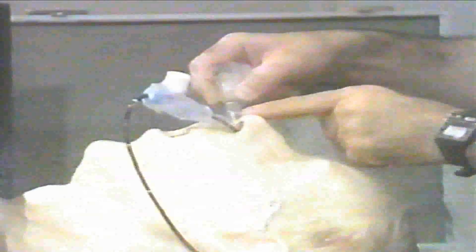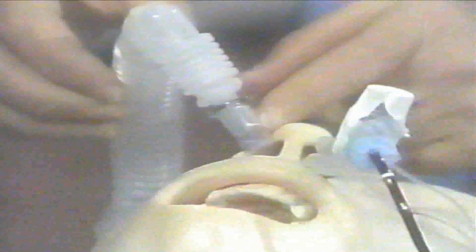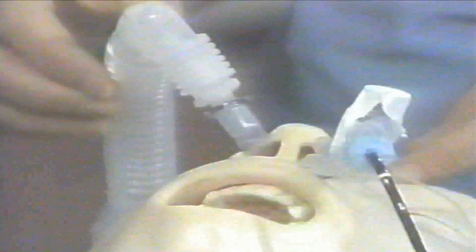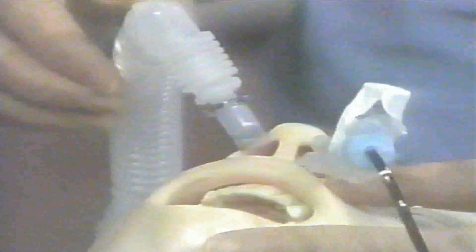Another aid to fiber optic intubation is to insert a nasal airway through one nostril attached to the anesthesia machine, and anesthesia can be established while spontaneous breathing is continued, or it can be assisted by keeping the mouth closed and assisted ventilation.